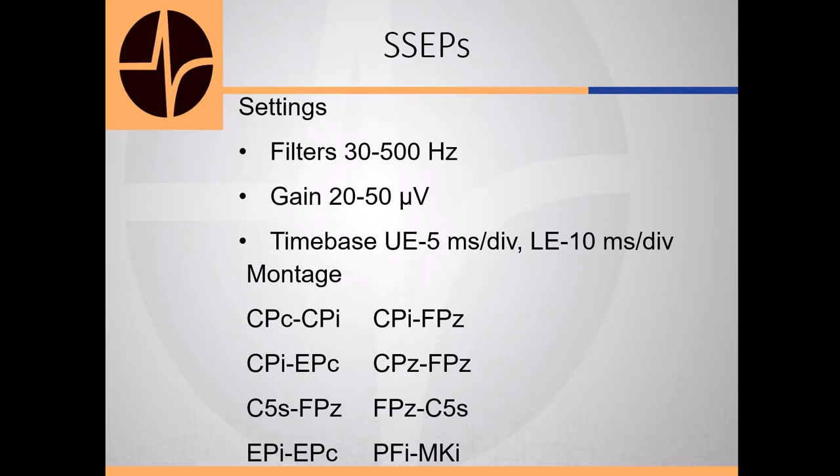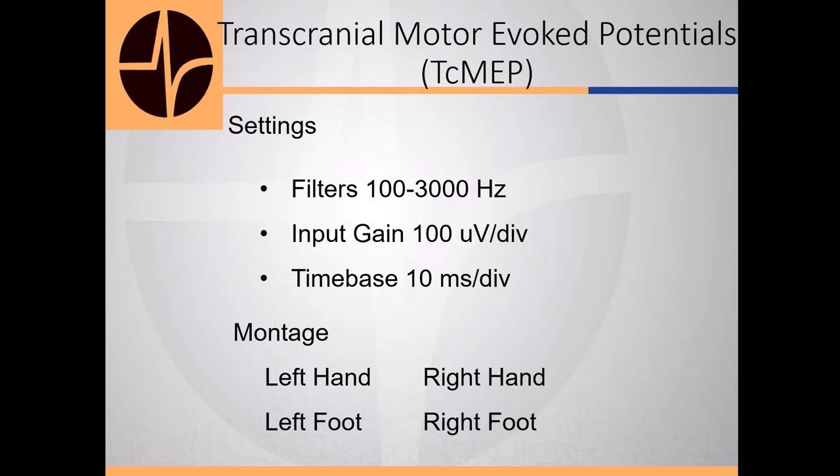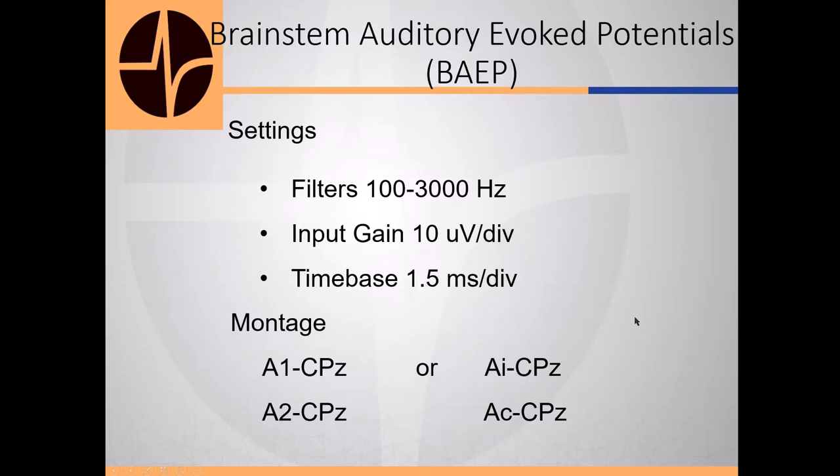SEPs on these, you're going to use the exact same montages. Same with any cranial nerve or EMG you're going to use. Same with your motor evoked potentials, except that you really only need the hands and the feet. Brainstem auditories, normal montage.